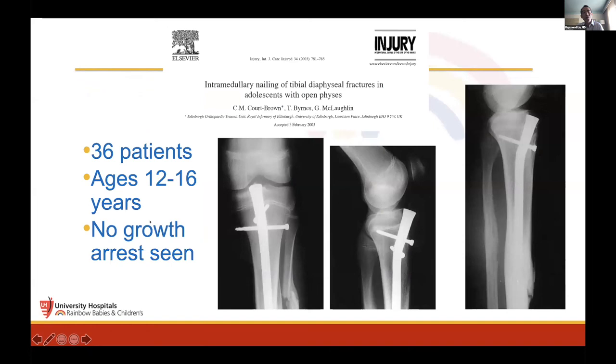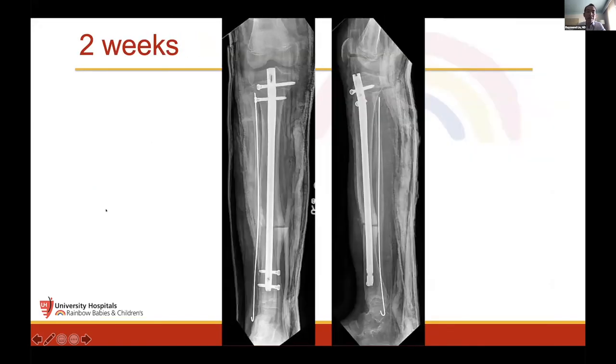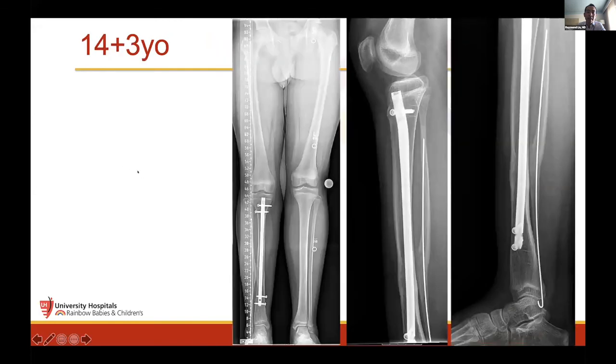The proximal tibia is totally different because the entry of the nail is so anterior, and we know that growth plates don't like it when you violate them eccentrically. They're much more tolerant of being violated centrally. And so in the proximal tibia, you have to do that. So there is some risk of developing recurvatum if you do this type of approach. This study did not find any cases, although their patients were pretty close to skeletal maturity. I have had one patient where I placed a nail that came out fairly anterior through an open growth plate. And I watched them. A year and a half later, I'm looking at recurvatum of that proximal tibia. So I've created a growth arrest proximally, or at least growth inhibition enough that I developed this deformity, and that's something that has to be treated in the future, unfortunately.